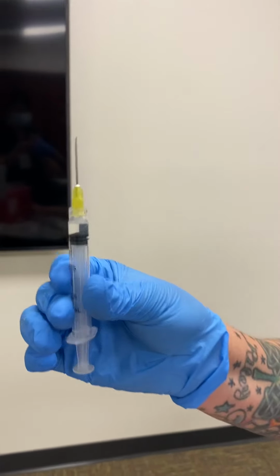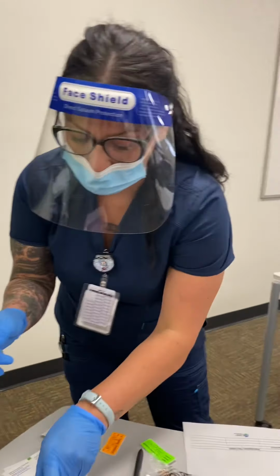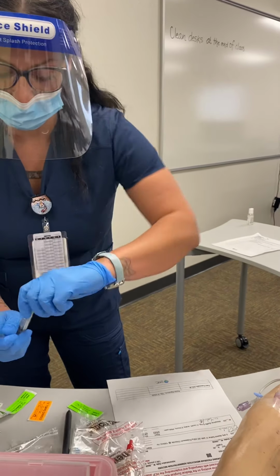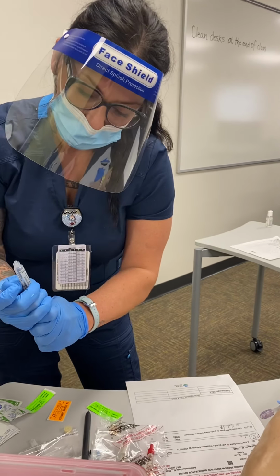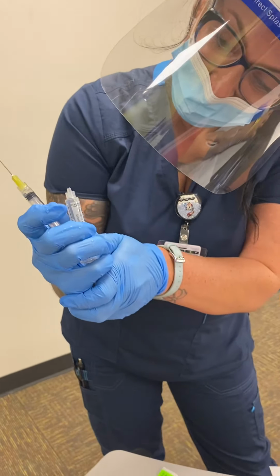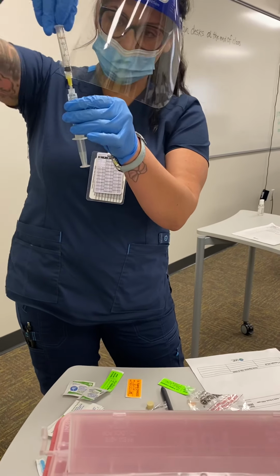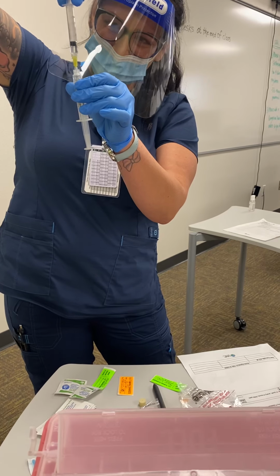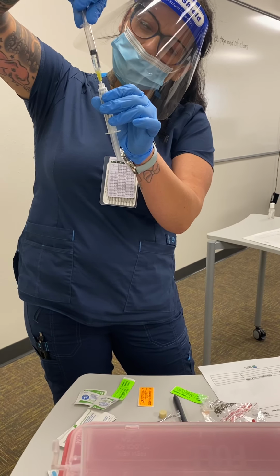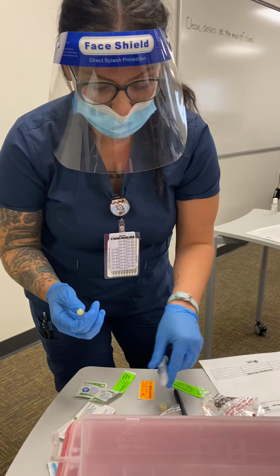I'm going to confirm with my second nurse. Looks good. Okay. And now I will get my 3 mils of normal saline. And we're going to withdraw 1 mil, so make it 1.4. Okay. That's good.